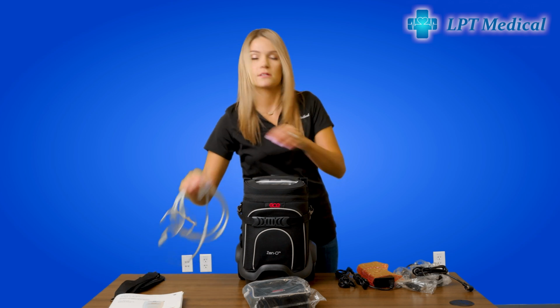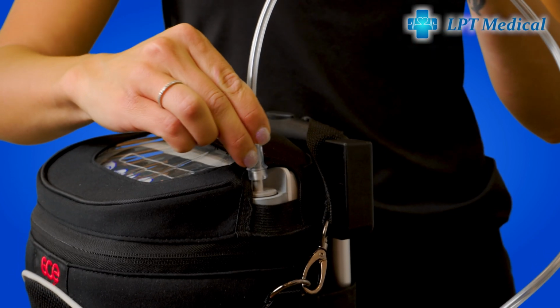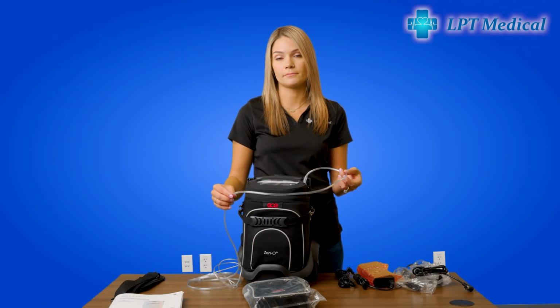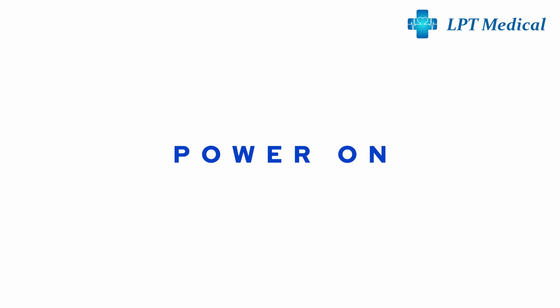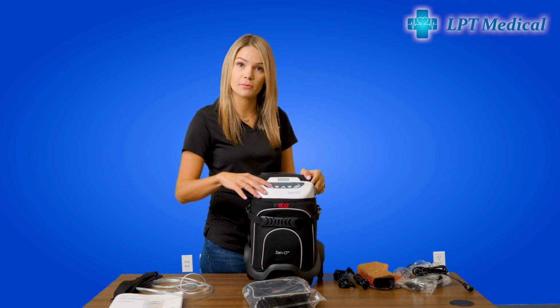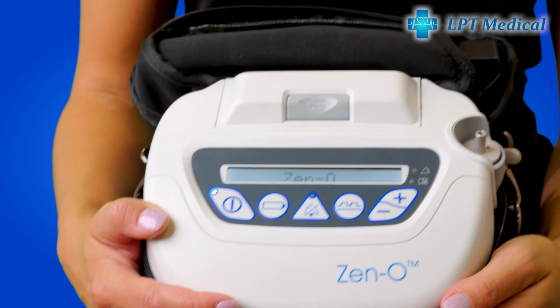And now we will install the cannula. It goes directly on top. And now it is ready to turn on. So to power on the GCE Zeno, you're going to simply press the power button. The unit will power on.